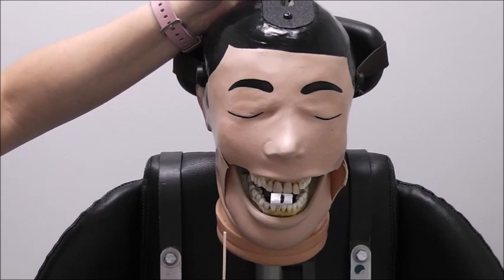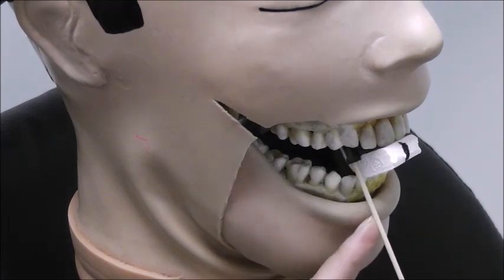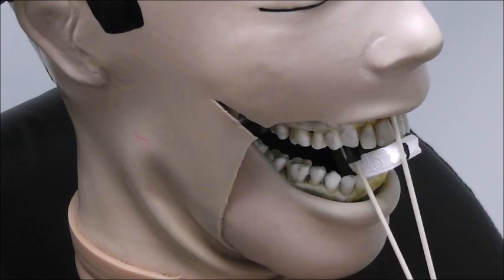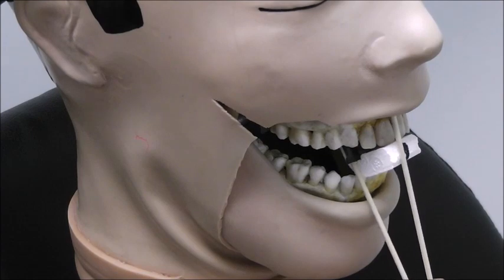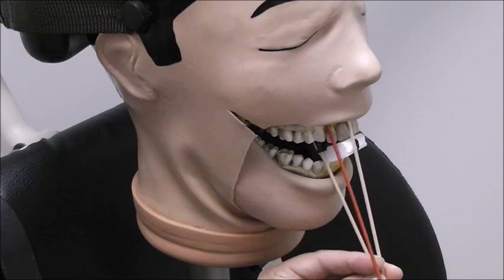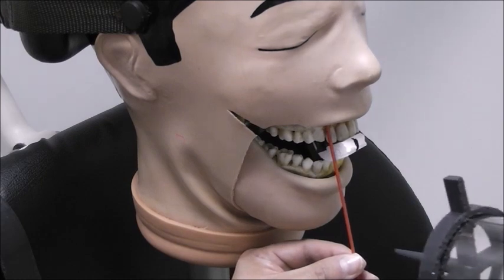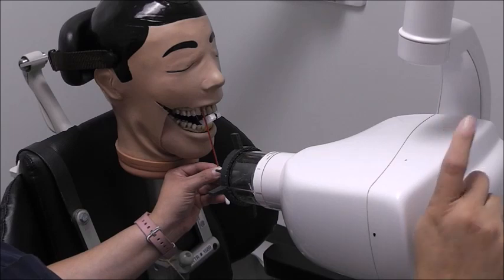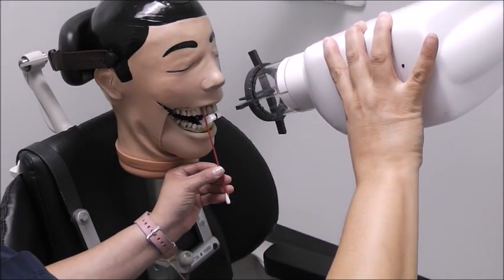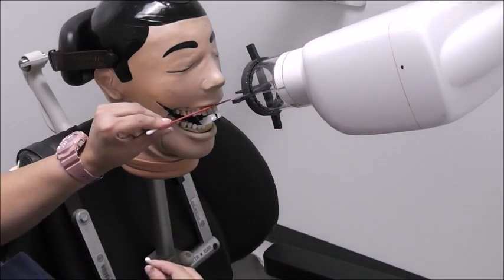This is your central view. I'm going to show you how to find the bisecting angle of the central incisors. We're looking for the orientation of the plate — that's your first angle. Then we're looking for the long axis of the centrals — that's your second angle. That forms a triangle; we're going to cut the triangle in half, and that half is our bisecting angle. We're going to parallel the collimator to the bisecting angle. The arm goes behind the patient, with the focal spot on the tube head facing up.